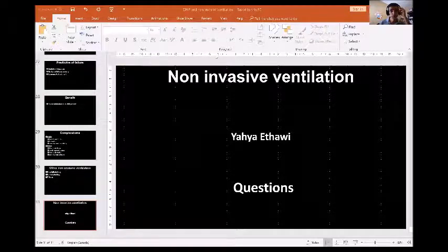Minimum PEEP in a newborn in a ventilator? I think 5 would be reasonable minimal PEEP in a ventilator. A minimal, well, that's another topic. We're not talking about ventilation. Max PEEP, 14, 15. Max PEEP in a ventilator up to 14.